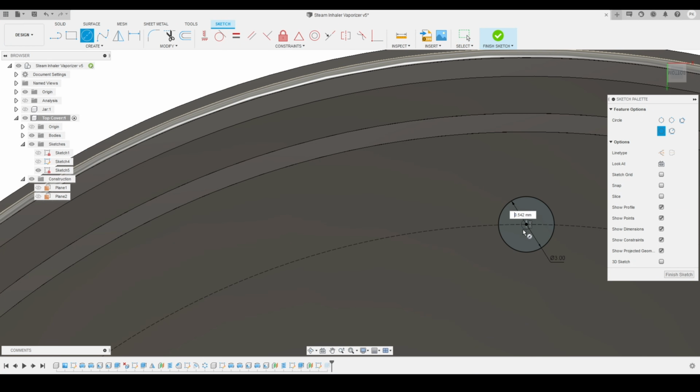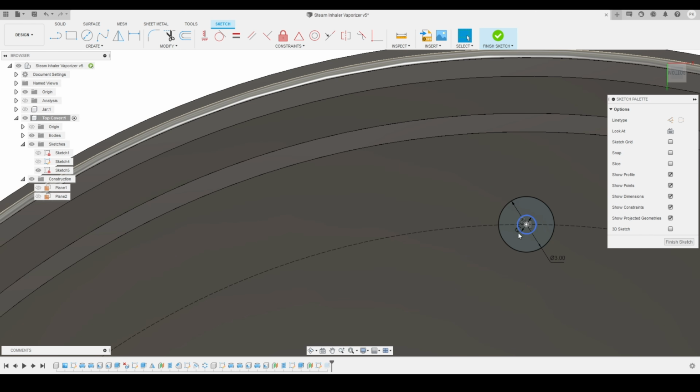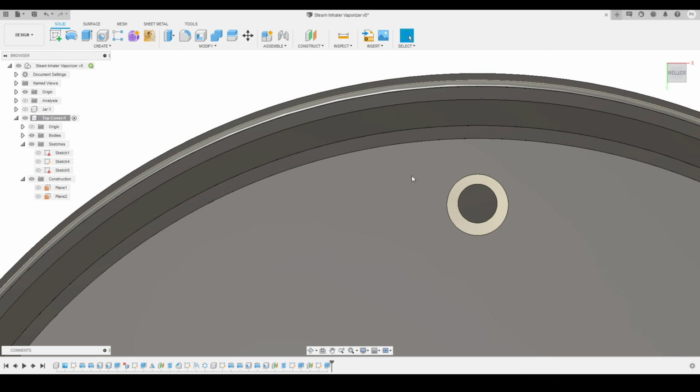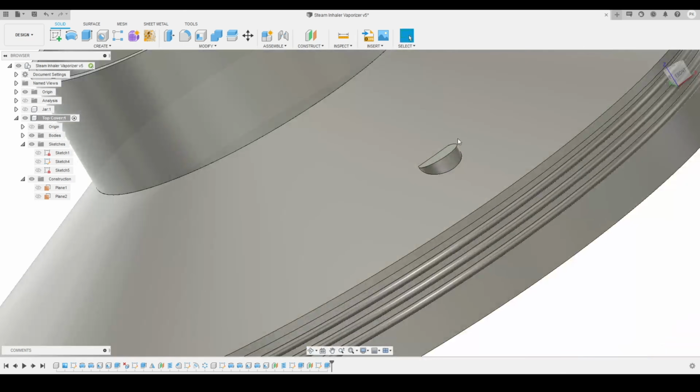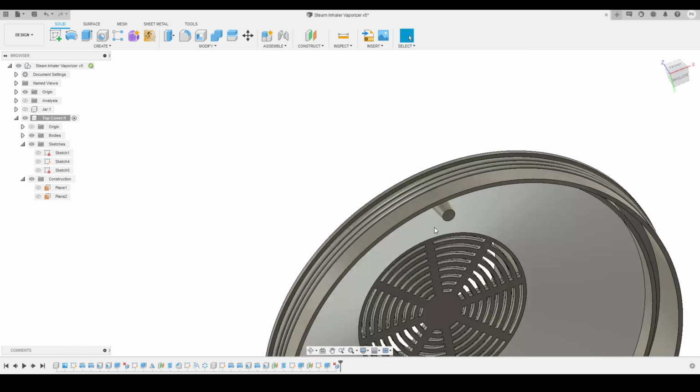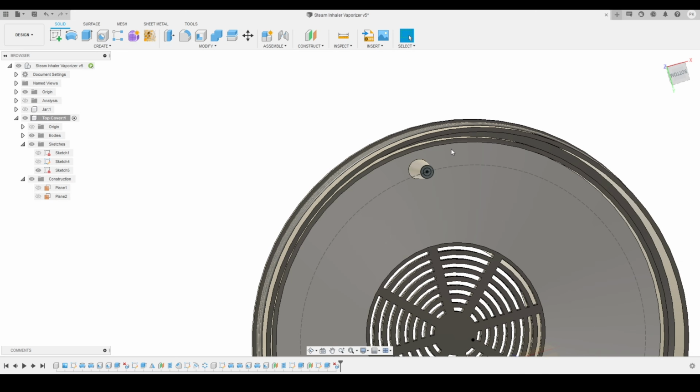Now I am going to go back to our sketch and create one more circle at the same center, of diameter 1 millimeter. It is just 1 millimeter in diameter. I will increase it a little bit to 1.8 and press OK. Now I will select these two faces and press delete on my keyboard to delete this extra profile, and then turn on my sketch back again.